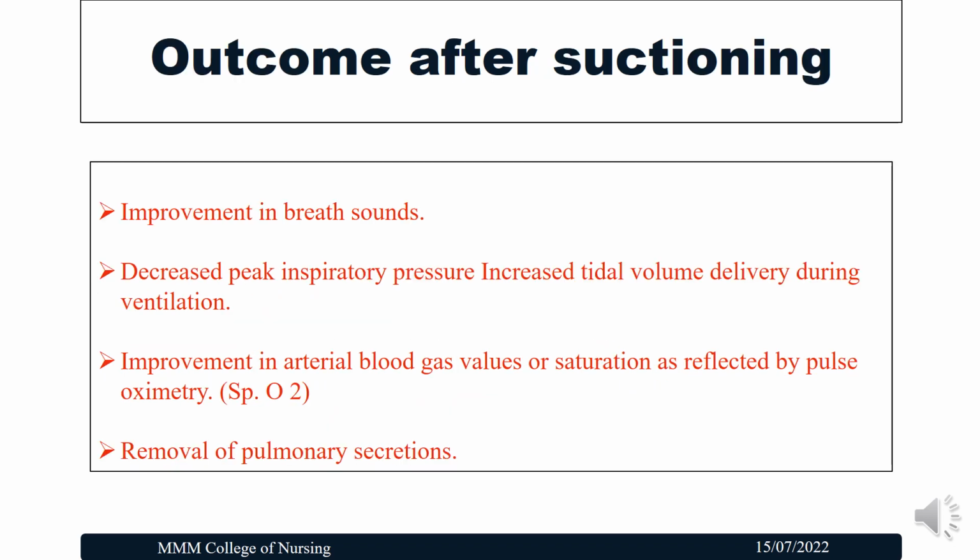What are the positive outcomes after suctioning? If the suctioning is effective, there will be improvement in the breath sounds, decreased peak inspiratory pressure, and increased tidal volume delivery during ventilation. There will be improvement in arterial blood gas values or saturation as reflected by the pulse oximetry, and a large amount of pulmonary secretions will be removed, and the patient will feel very comfortable after the suctioning.